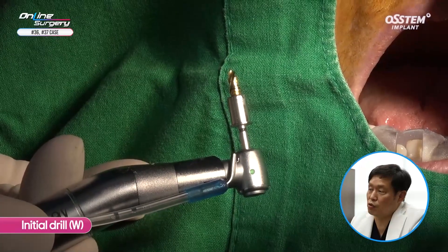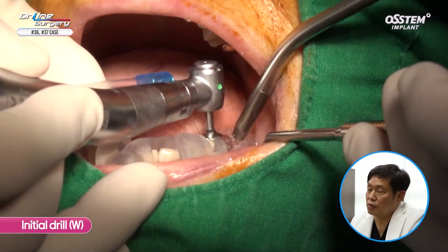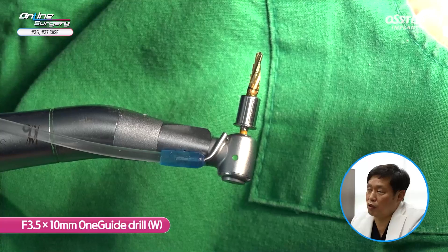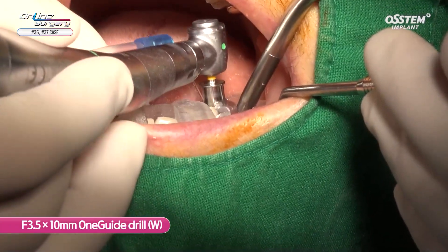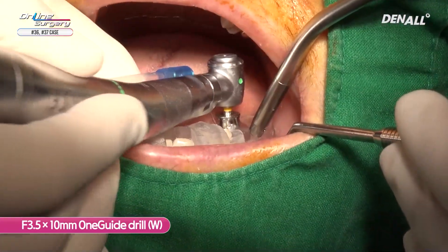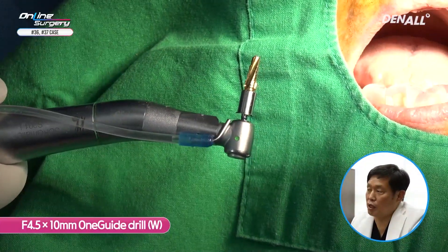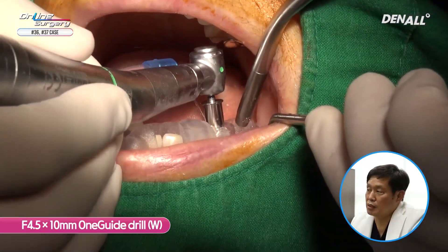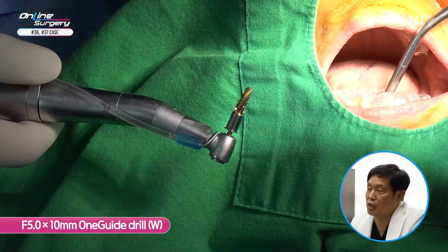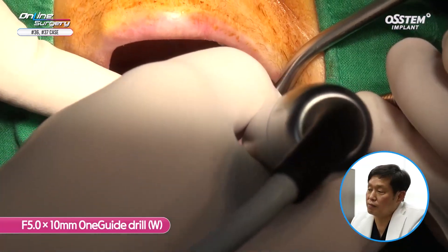The initial drill is used. In number 36, drilling is done. Next, a 3.5 x 10 mm One Guide drill is used. Then a 4.5 x 10 mm One Guide drill is used. You can skip right to 5.0 but if the bone is hard, you can use 4.5 first. I am using a 5.0 x 10 mm One Guide drill full length.